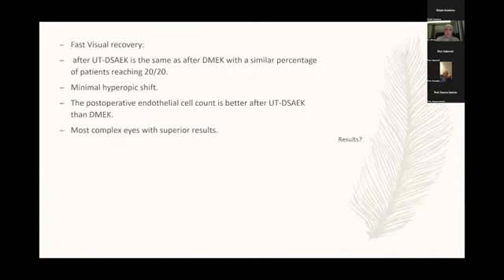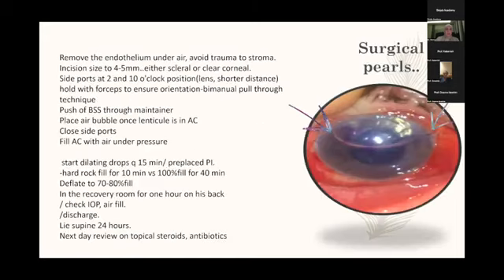Sometimes this has been mentioned, either for 10 minutes or 40 minutes. And in the recovery room, keep the patient for 1 hour on his back. Checking the intraocular pressure is very important. I don't discharge the patient until 1 hour to make sure that the intraocular pressure is good and the airfill is sufficient. And then I discharge. It's very important for the patient to lie supine for 24 hours after the procedure. And the next day review the patient with topical steroids, antibiotic drops.